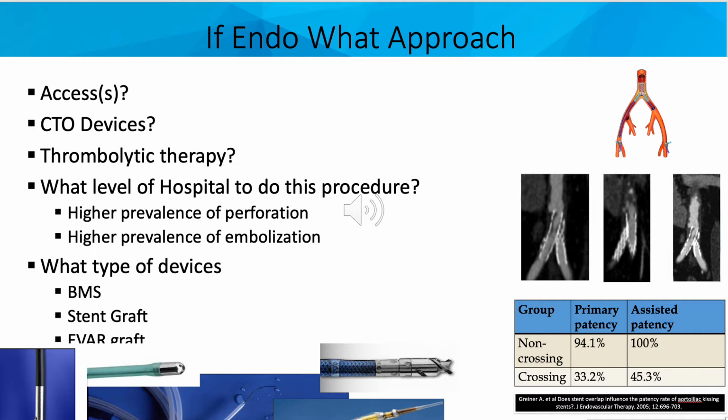Also, beyond that, let's look at the CTO devices. There's a multitude of ones that could be considered, from a catheter and wire up to the very advanced luminal devices or even the reentry devices.